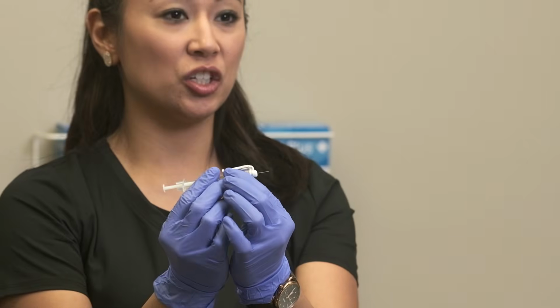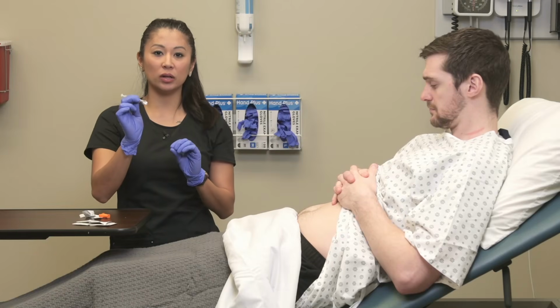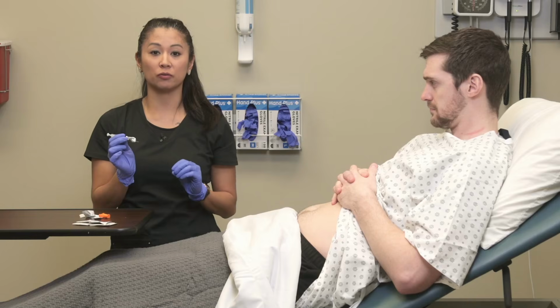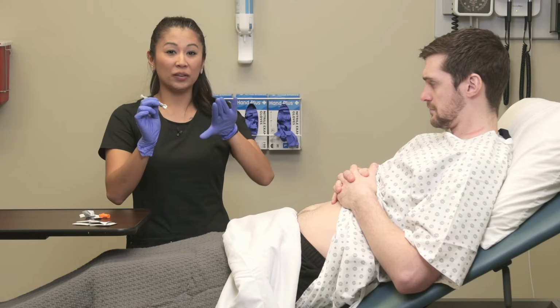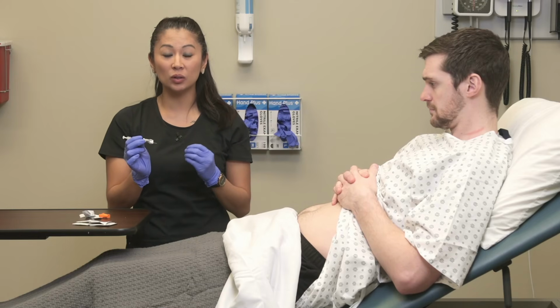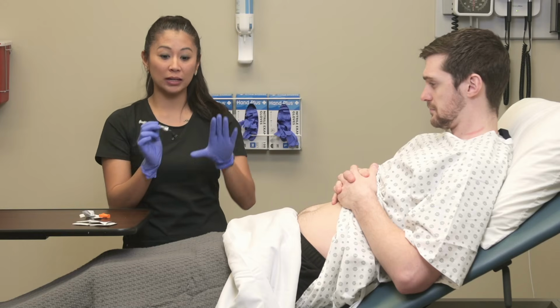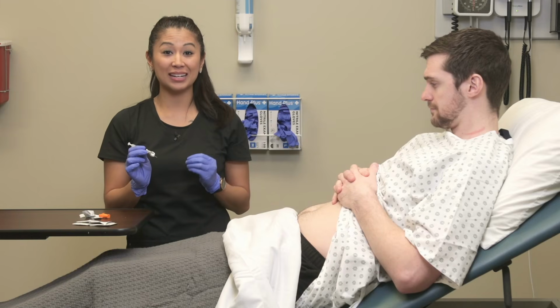Then when I position this, everybody holds these differently. I want a nice firm grasp, and also notice how I have it. When I've got a hold of that needle, I'm going to make a dart-like motion for our patient. This is important because a lot of times when we go to inject, we're very nervous about hurting the patient. Think about this as a needle. We want it to pierce the skin. It's nice and sharp, so don't forget about that dart motion anytime you give an injection. So don't forget to dart.